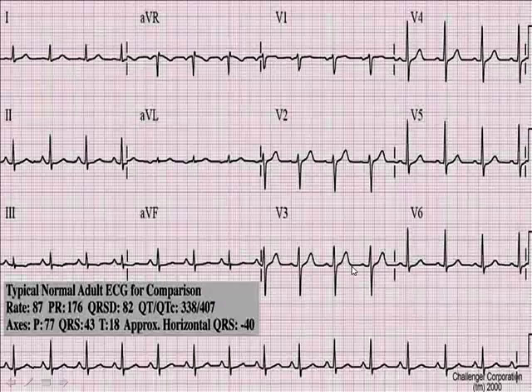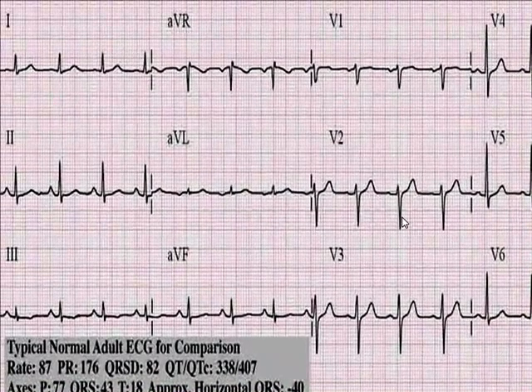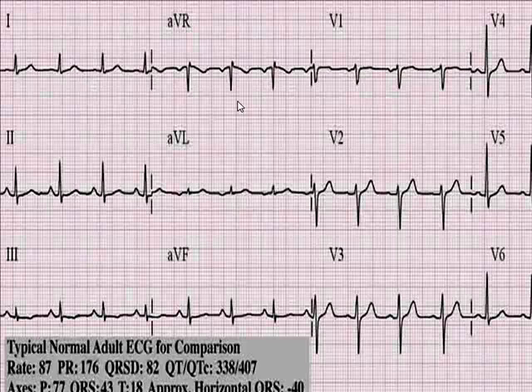All these leads are viewing the heart from different directions, but they occur at the same time, as if you were seeing an object by 12 persons from different directions, and everyone at the same time telling you what he is seeing.